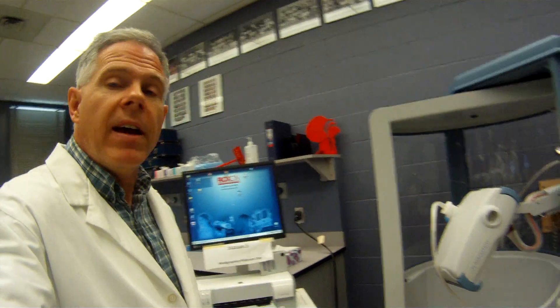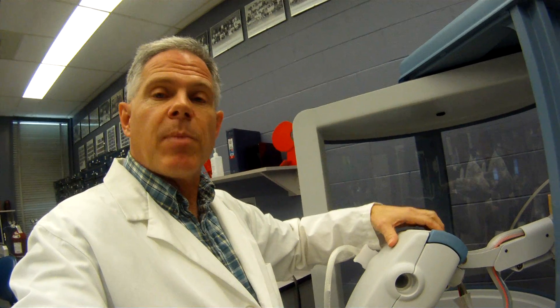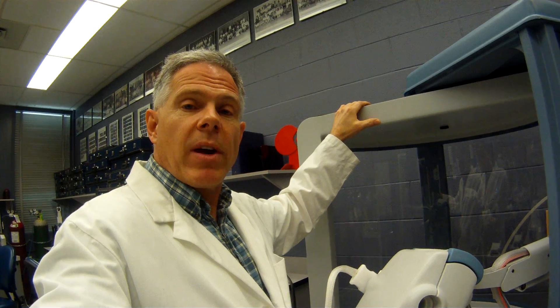Hi, my name is Alan Prost, and I'm going to introduce you to the Platinum Elite Series pulmonary function testing, as you can see right here. This includes a body box, as well as spirometry and gas analyzing capabilities, so we can do all the major pulmonary function testing right here.